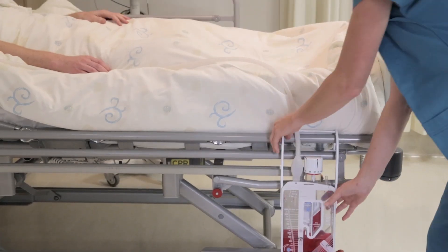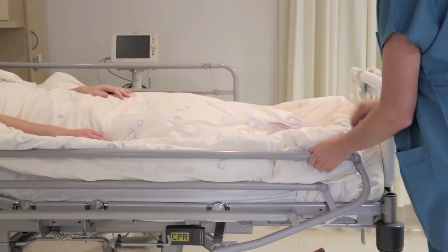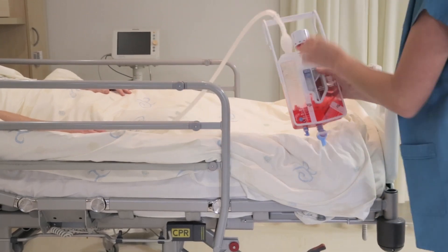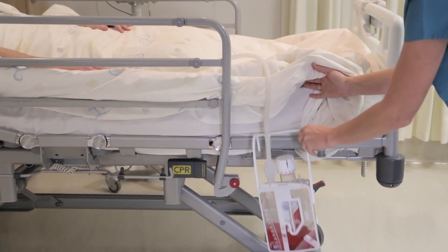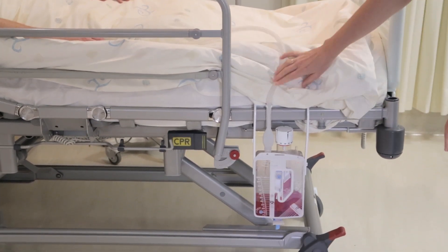During repositioning or transportation of the patient, the device can be placed flat horizontally on the bed next to the patient. It is safe to lift the unit higher than the patient, making nursing care and patient mobility easier. However, when unattended, the device should hang next to the bed.